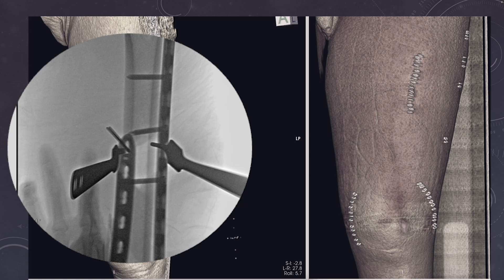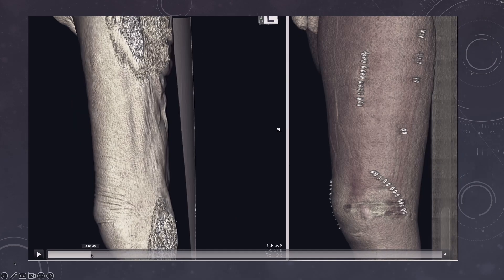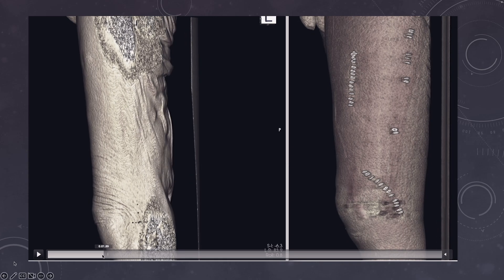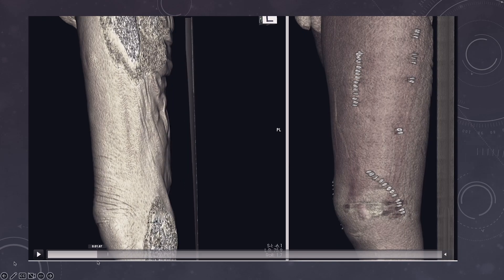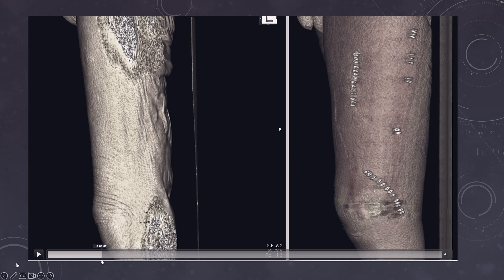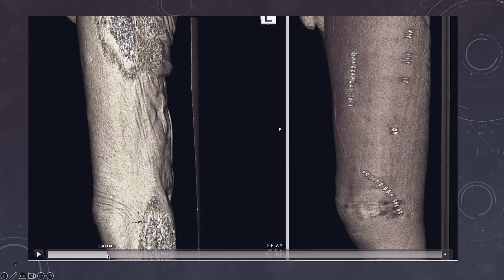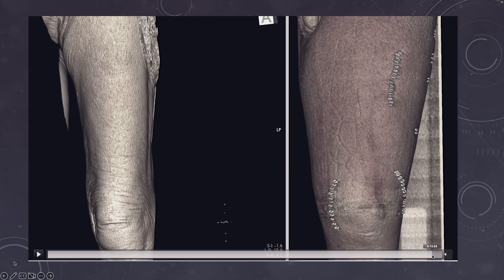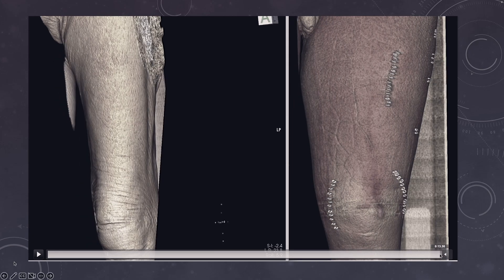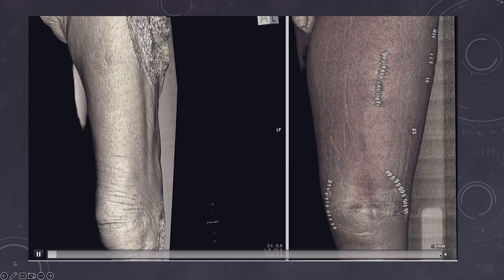Your proximal incision is in line with the shaft. You can see the markings of the incision — one is on the lateral side and one is on the medial side. The lateral is quite different from the typical one because of the associated open wound, which resulted in modification of the incision in the distal part. The first incision is on the medial side directly over the condyle, and the proximal incision is in line with the shaft of the femur.